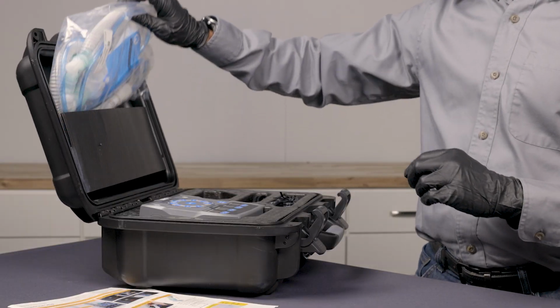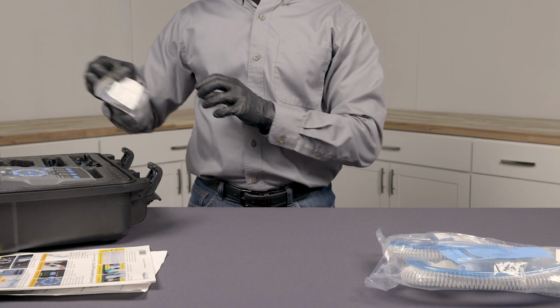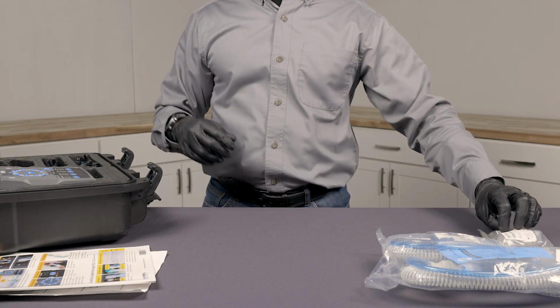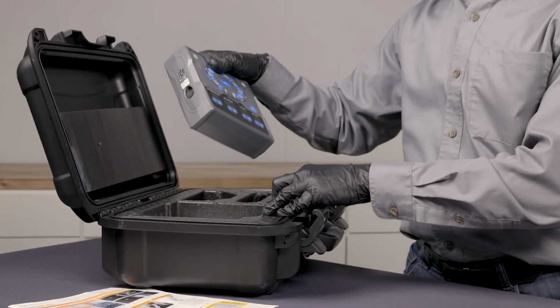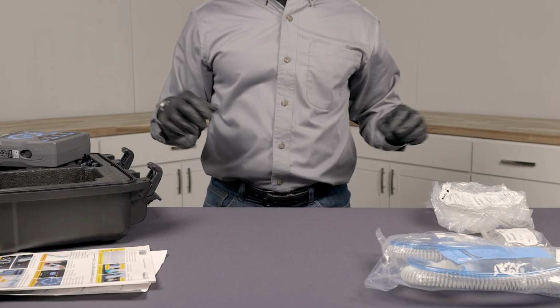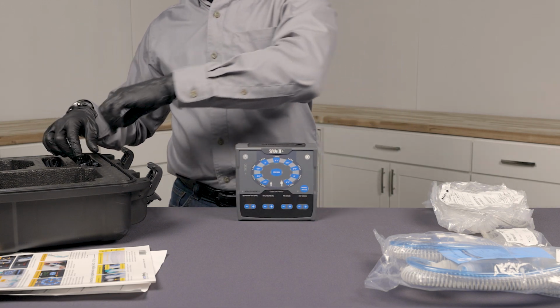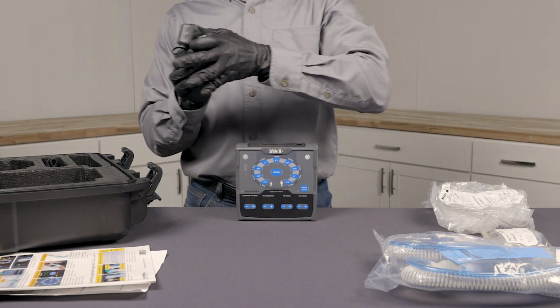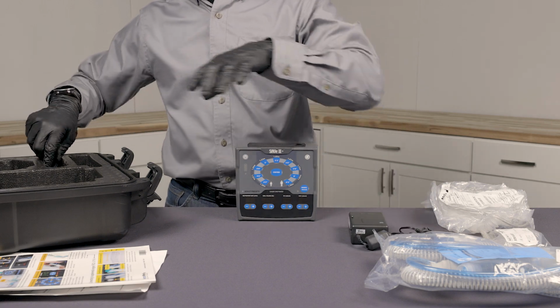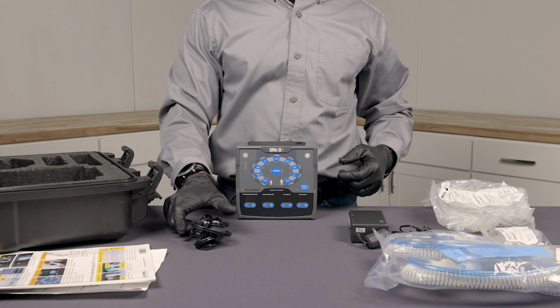Next, you will want to remove the patient circuit, the noise attenuator, and the extendable O2 reservoir tube. And lastly, let's remove the ventilator and the power cord from the case. Now you're ready to test it out.